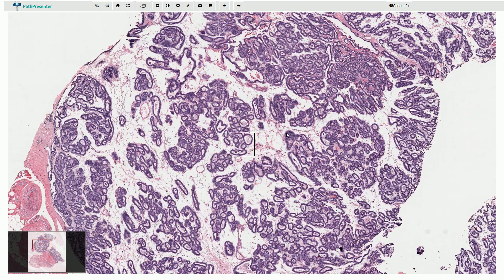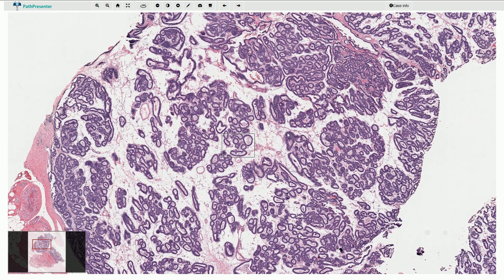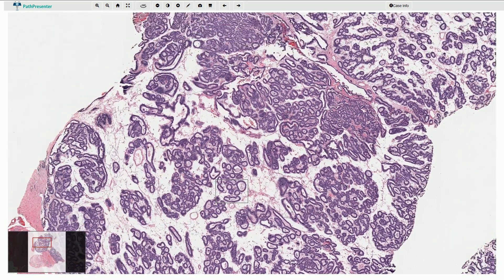The differential diagnosis includes basal cell adenoma and pleomorphic adenoma. Basal cell adenoma usually does not show beading and the cells are basaloid and not columnar. In most pleomorphic adenomas the canalicular pattern is not very prominent.